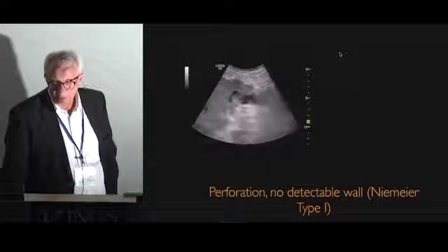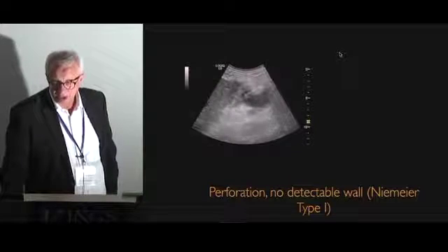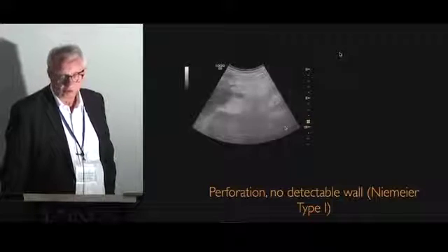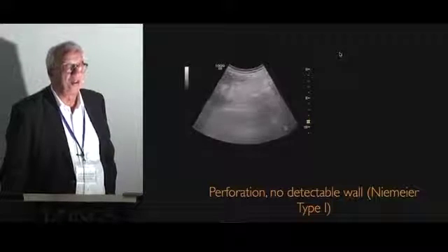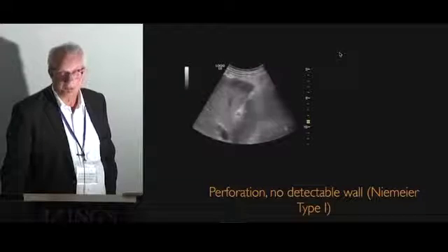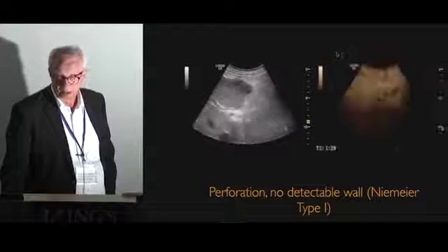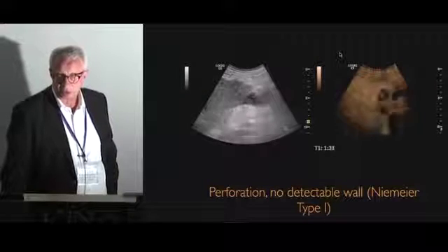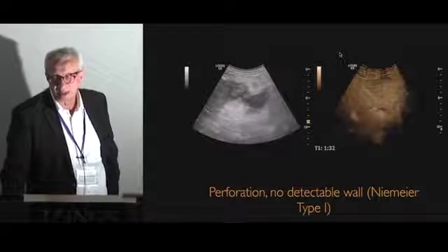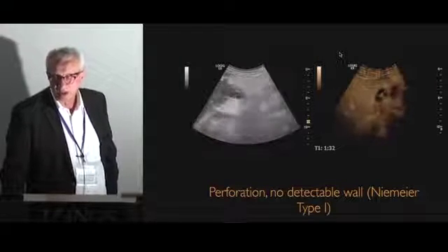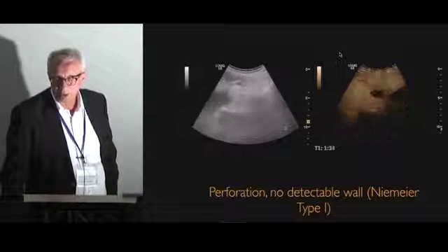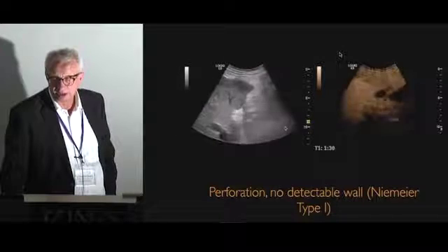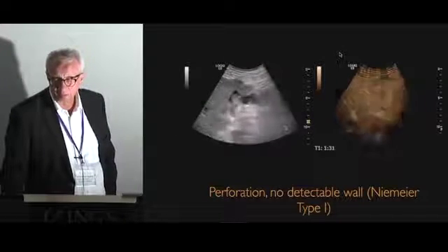This is a Niemeyer type 1 perforation — you don't see any gallbladder anymore. With contrast you can see a little bit better the free fluid, which is bile in the free abdomen.